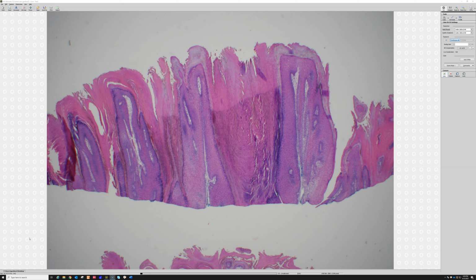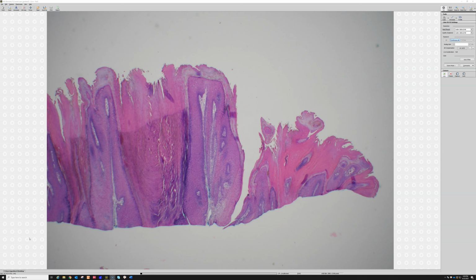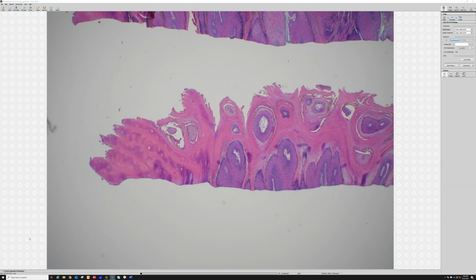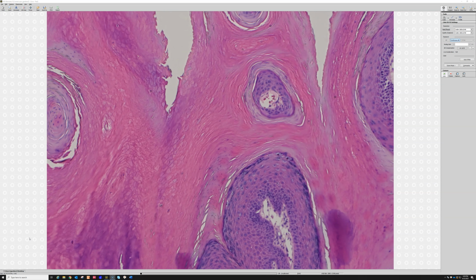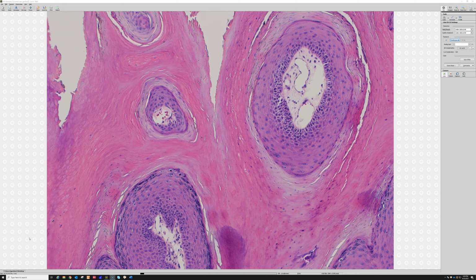Now, this was a young patient, and so I didn't need to hedge or say, oh, well, it could be a squamous cell carcinoma. I just said verruca, superficially sampled. But it's a good example of what the top part of a wart looks like. See, we're just seeing those top papillae. I'm not seeing the base, but in this patient who's young, and also, if I recall, this particular case had coilocytes too. So bonus.